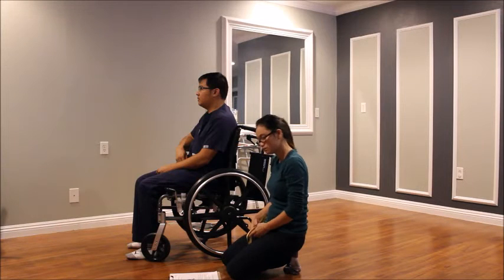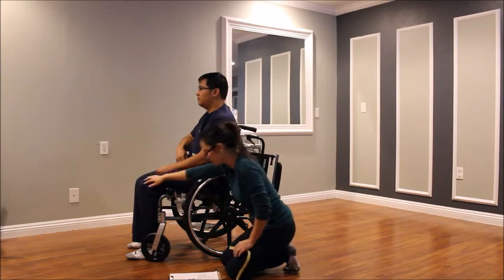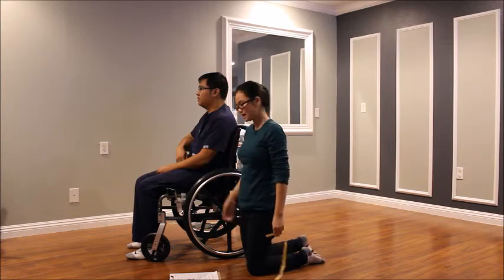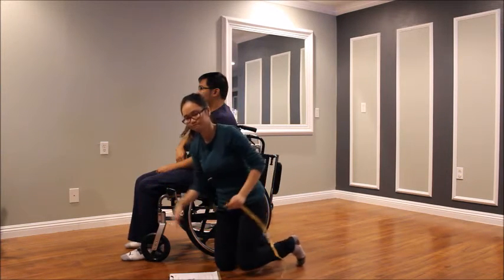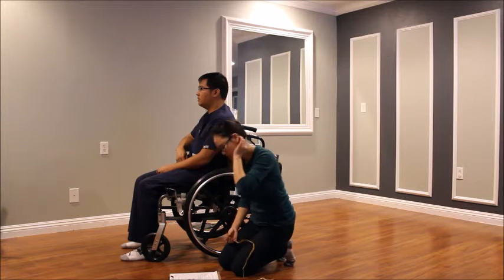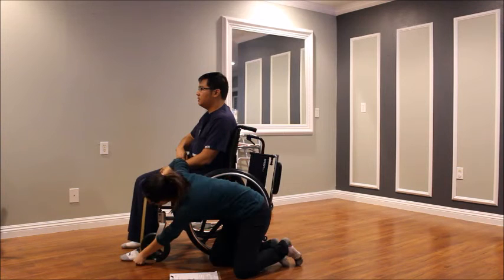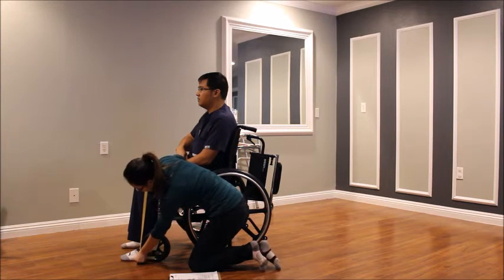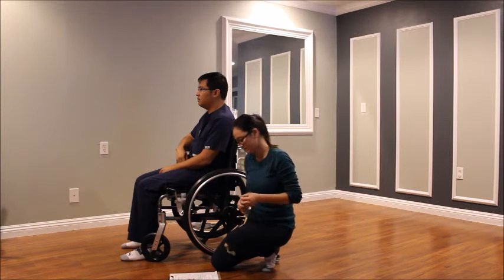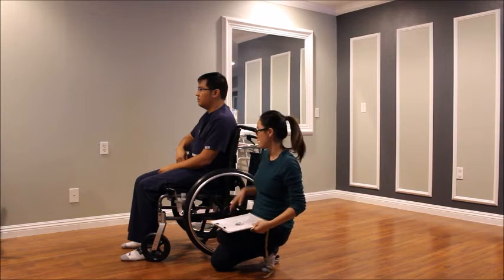And the next one we'll measure is seat height. So the knees and the ankles should be positioned at 90 degrees. Okay, right here. And we measure from the back of the bent knee all the way down to the heel area. And that's about 19 inches.